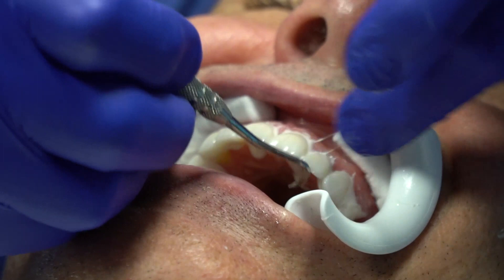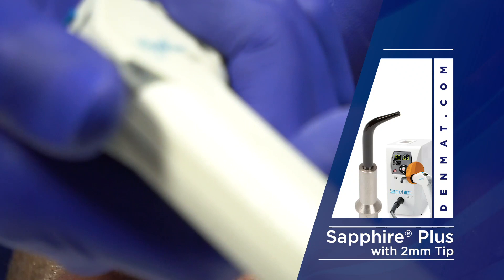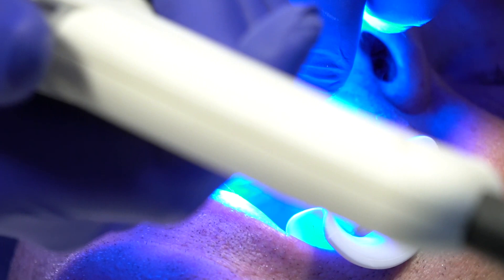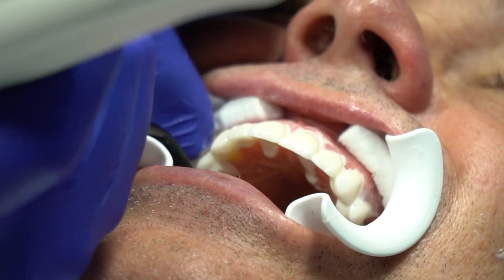What I'm looking for now is any that look out of alignment. I may take the mirror from the incisal edge and look down — are they all seated, does everything look good? At this point I would tack each one for one second. The way I normally do it: take the incisal edge, seat it down, let it go. Don't push on the veneer — this is supposed to be a passive fit, not biting down on an orangewood stick.